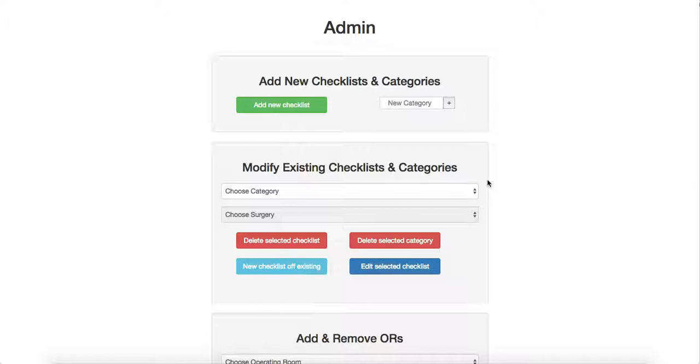This was a project aimed at affecting the way that anesthesiologists currently set up the operating room. There is not a standardized checklist in place, and there's often 30 or 40 steps done from memory. So the overall problem that we were trying to solve in this project was delays in the OR due to mistakes or forgetting certain parts of the setup, as well as improving outcomes or complications for patients.